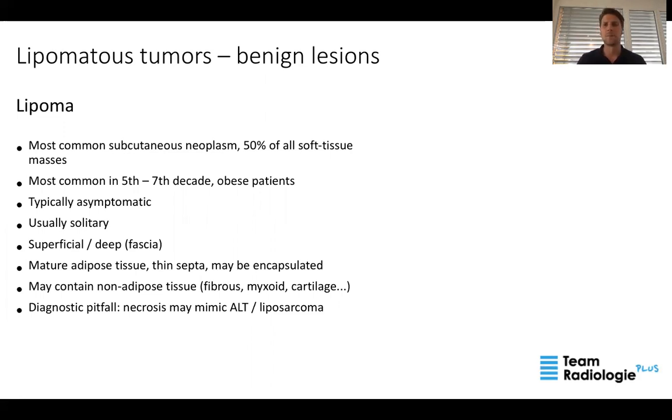An important diagnostic pitfall you should know is the presence of necrosis inside a lipoma, because necrosis inside a lipoma may make the tumor look more aggressive than it actually is, and it can then easily be confused with an atypical lipomatous tumor or even a liposarcoma.